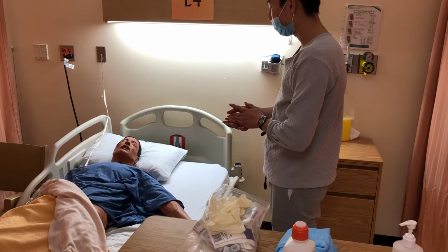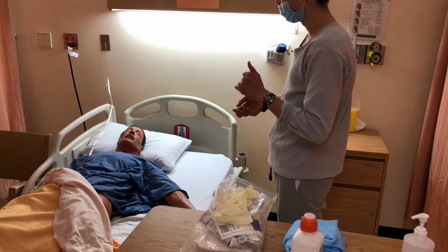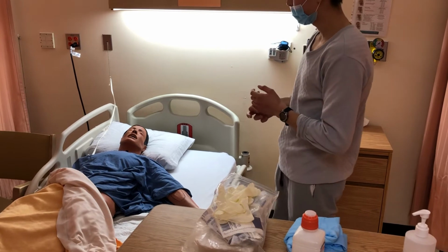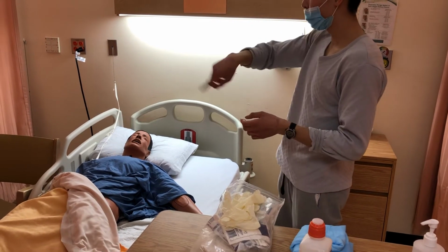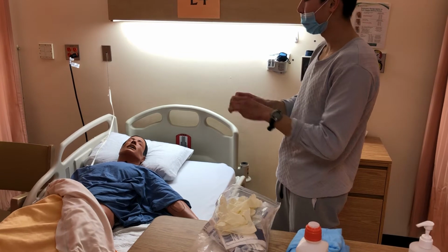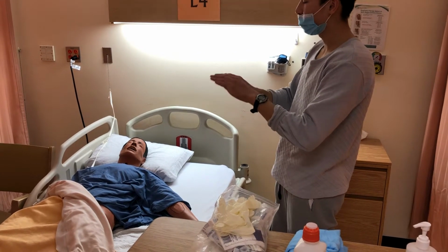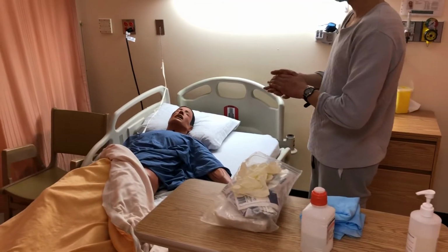Okay, so Ms. Maragmo, the reason why I'm here is we got the physician's order for us to do a regular wound care and wound assessment on your left thigh laceration. That consists of removing the old wound dressing and assessing it, and then we're going to irrigate the wound clean, and then we're going to dry your peri-wound skin, assess the parameters of your wound, and then after assessing, we're going to put on new packing on your wound as well as new dressing. So is this all okay with you? She says yes, it is okay.